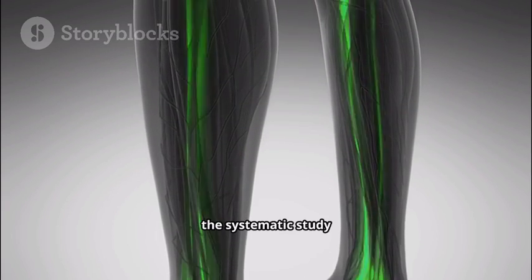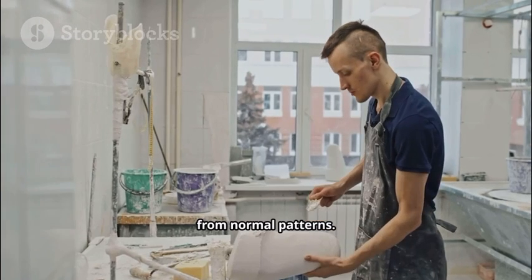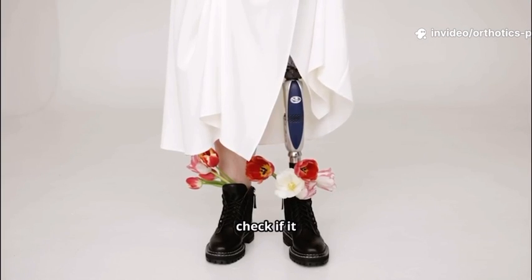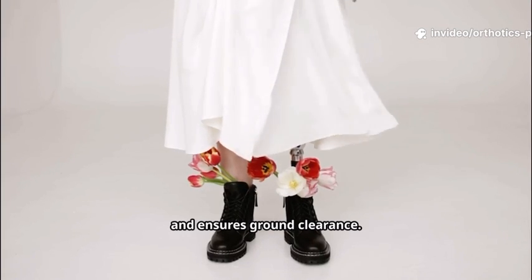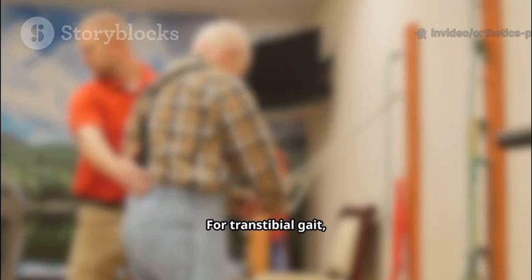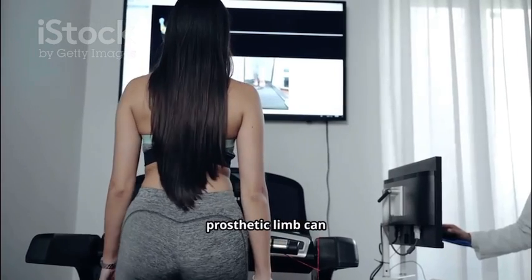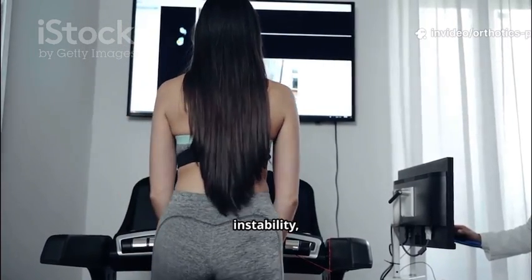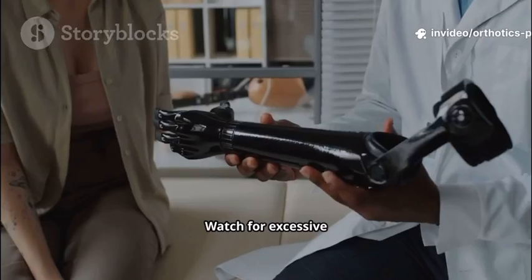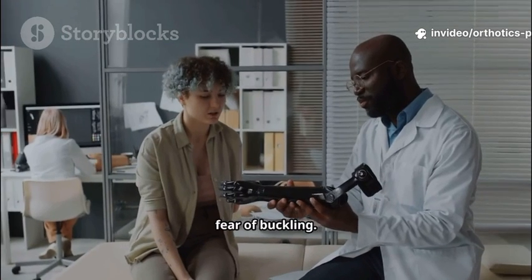Gait analysis is the systematic study of human walking. Identify deviations from normal patterns. With an AFO, check if it prevents foot drop and ensures ground clearance. Observe stance stability and ankle support. For transtibial gait, assess step length and timing symmetry. Less time on the prosthetic limb can reflect pain, instability, or lack of confidence. Watch for excessive knee stiffness, often compensation for weak hip muscles or fear of buckling.